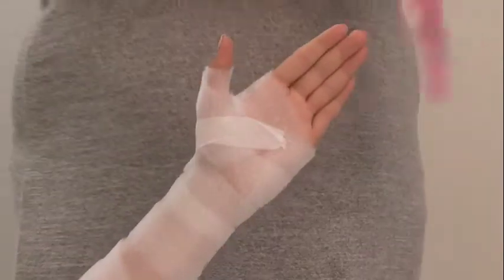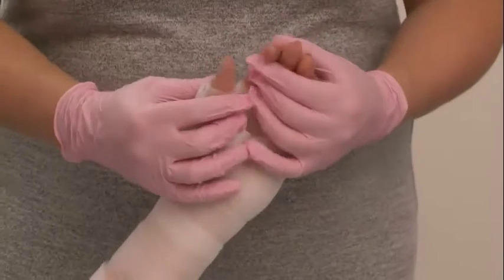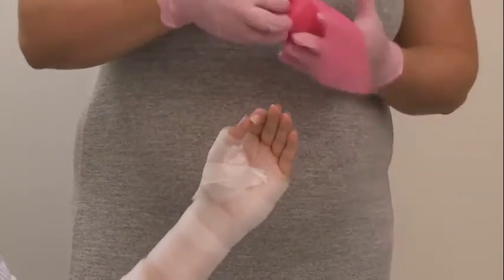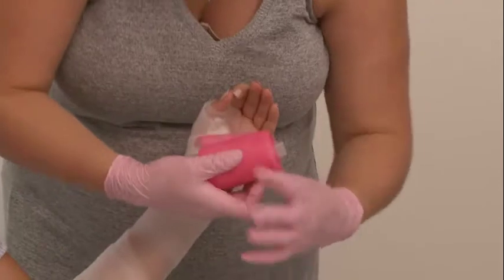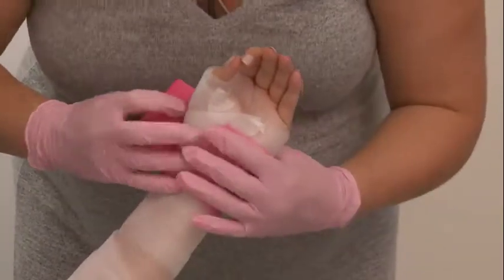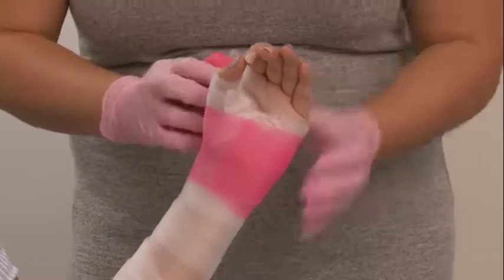From here, pop your gloves on, because the synthetic material resin is really sticky and really hard to remove if it gets on your fingers. Gloves on before you handle the material, and get your position again so you have nice opposition. I am using the size three, the 7.5 centimeter roll, and I would do that for most scaphoid casts. When handling the material and unrolling it onto the patient, try to unroll it away from your body — this makes sure you're not putting too much tension on the material so you don't have it too tight. At this stage you can see I'm going just above the distal palmar crease, leaving enough clearance for the MCPs to flex.